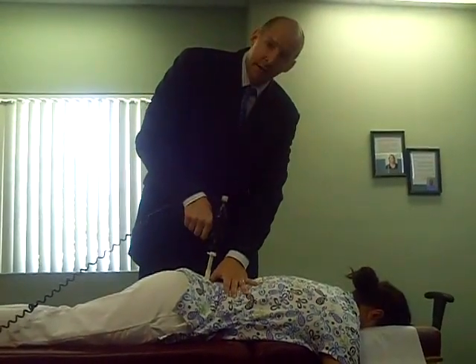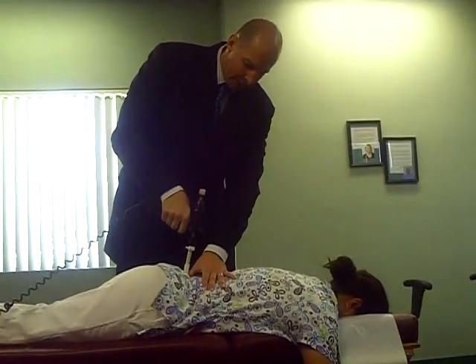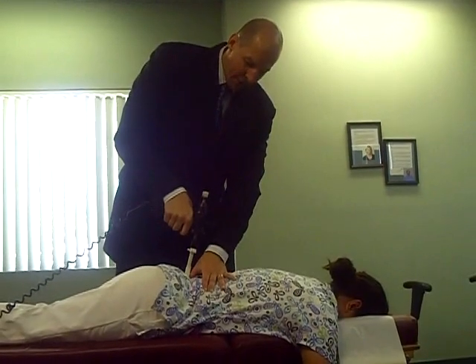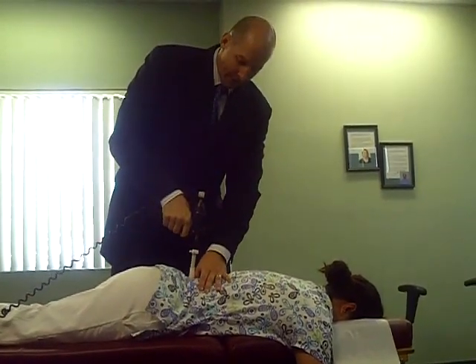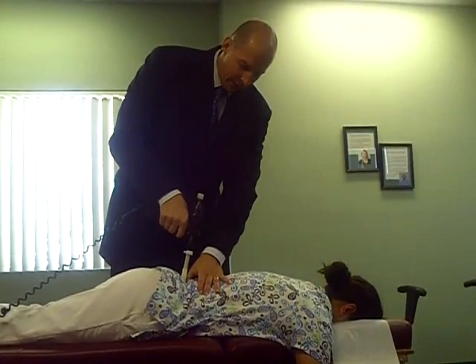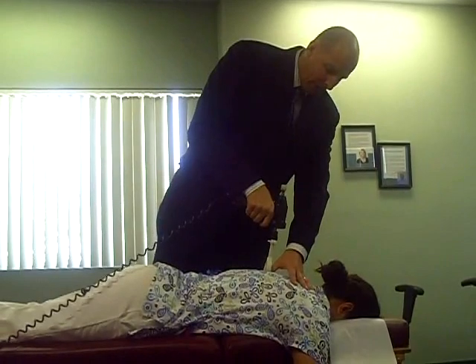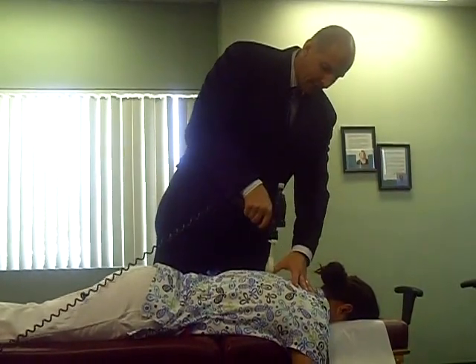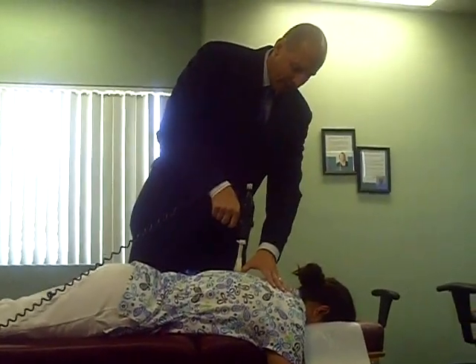For the lower back, for instance, I'll tap this area to adjust the lower back, the lower lumbar spine like this. I can change the amount of pressure by pressing in harder, or I can do really light taps like this. This doesn't hurt — this is really light, gentle adjustments to the lower back, mid-back area. Some patients cannot tolerate the adjustments that we use with our hands, so I'll use that.